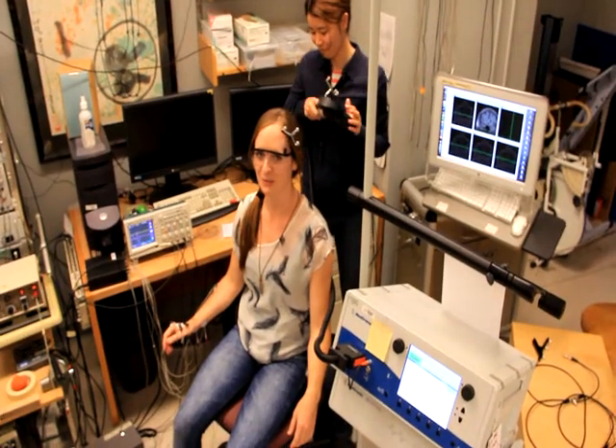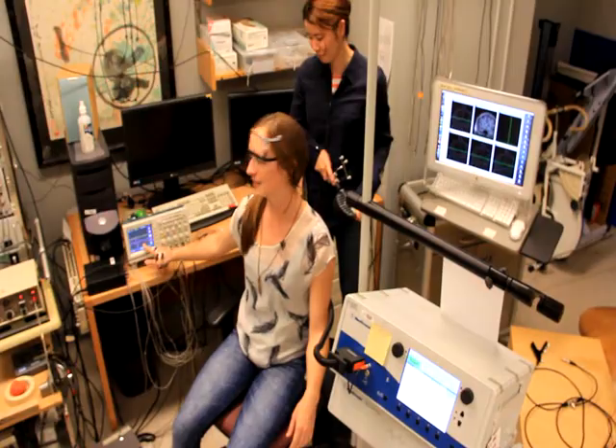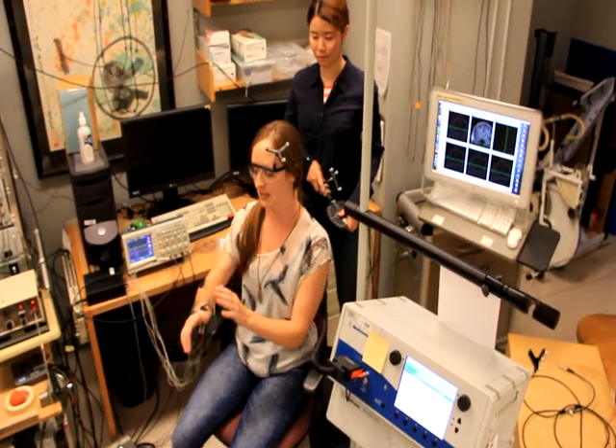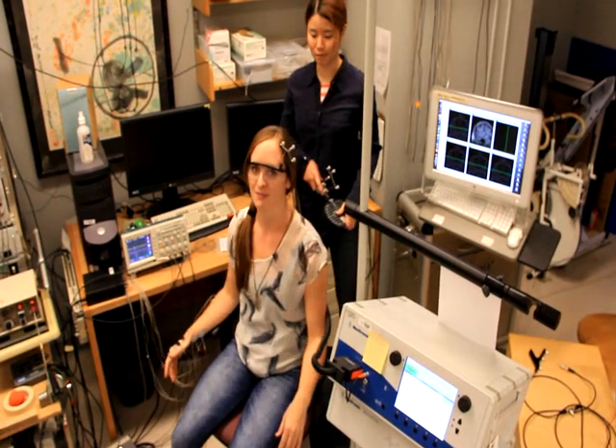You probably saw my arm twitch there. And we can also see this response over here on the oscilloscope, because we've measured it using the EMG electrodes over the muscles of my hand and forearm.